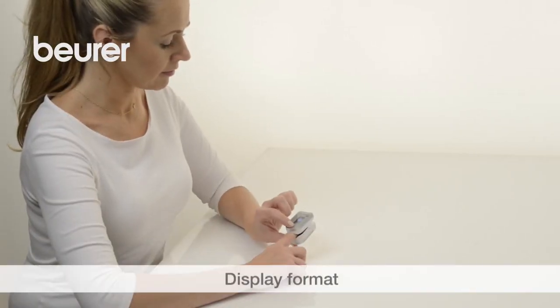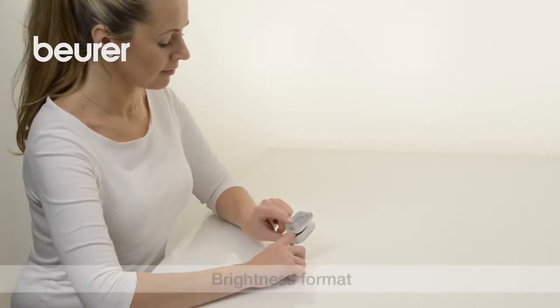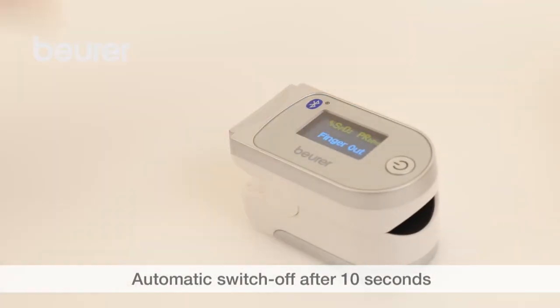Press the function button briefly to change between the different display formats. You can set the display brightness you want by pressing and holding the function button. The device switches off automatically around 10 seconds after you've taken your finger out.